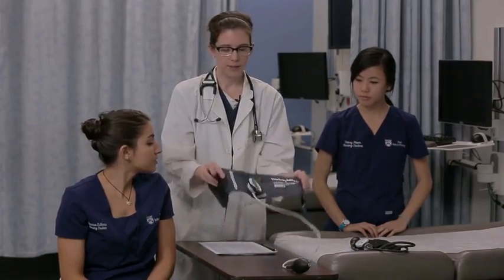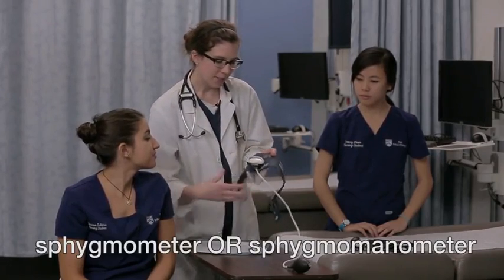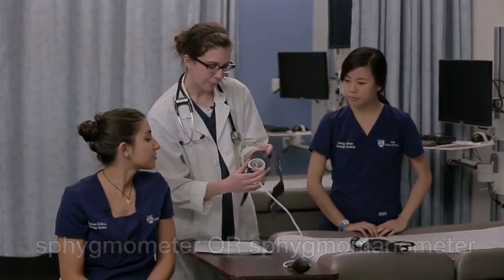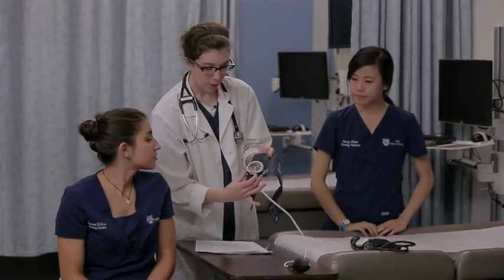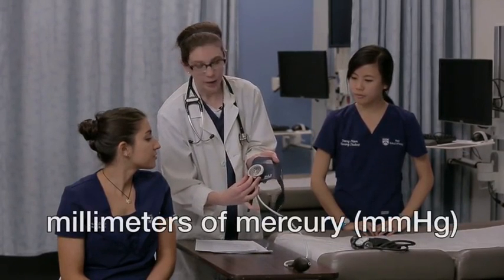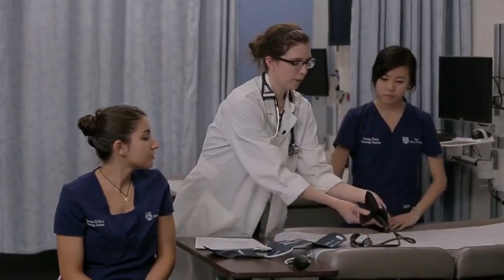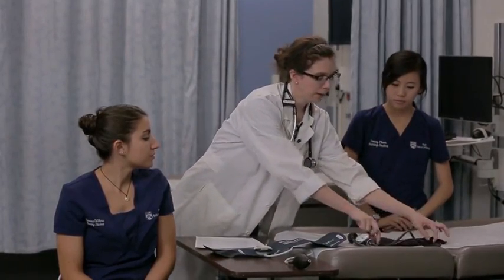Hi, welcome back to the Sim Lab. To get started taking blood pressure, you need to make sure you have the appropriate equipment. You need an inflatable cuff attached to a sphygmomanometer. You can see here that it has a gauge, which is measured in millimeters of mercury or mmHg — that's a pressure measurement. Cuffs come in different sizes. Here's an adult cuff, and here we have a pediatric cuff.